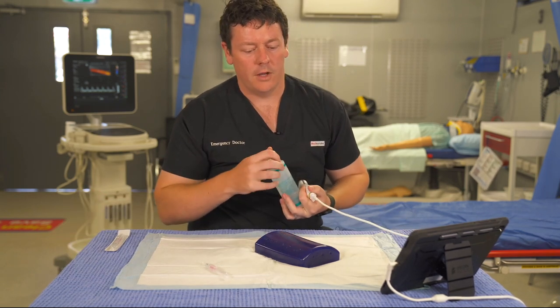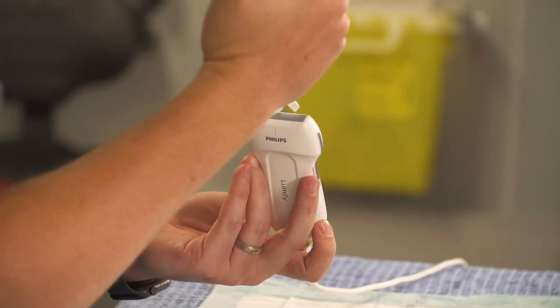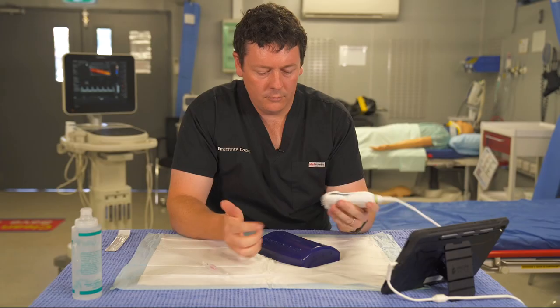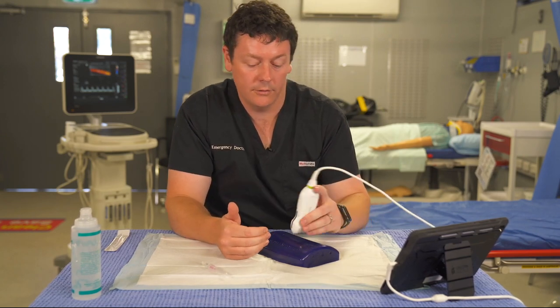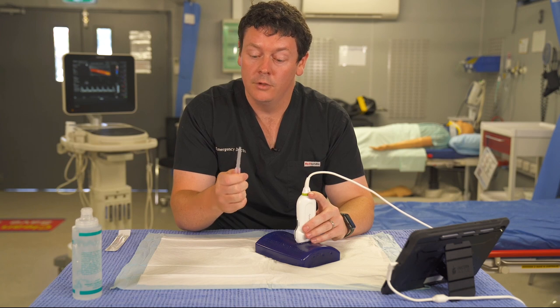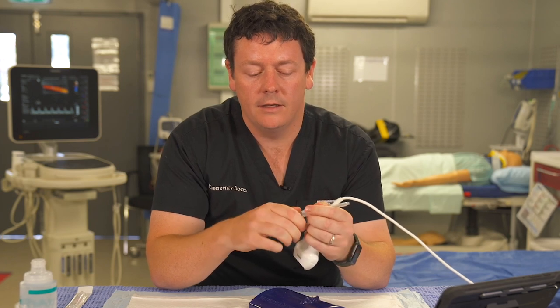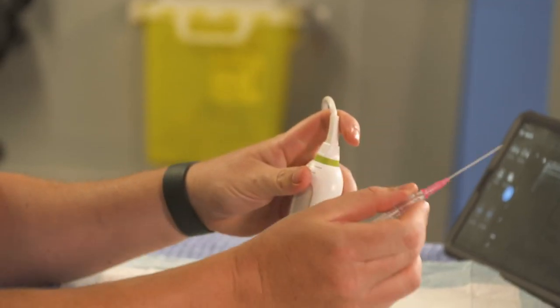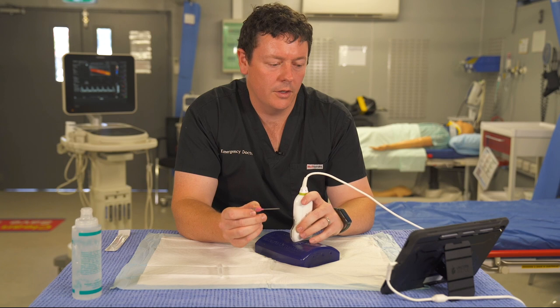We'll run through the two techniques. First, applying ultrasound gel to the probe and setting up the Lumify vascular view. We'll do out-of-plane first, which is the most common way people start needle guidance — meaning the probe is 90 degrees to where you insert the needle. This is most commonly used for vascular access, while in-plane is more common for nerve blocks. I recommend starting with out-of-plane as it's a little bit easier, then switching to in-plane once you've got the knack of it.